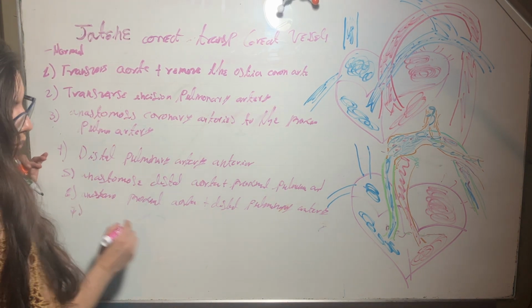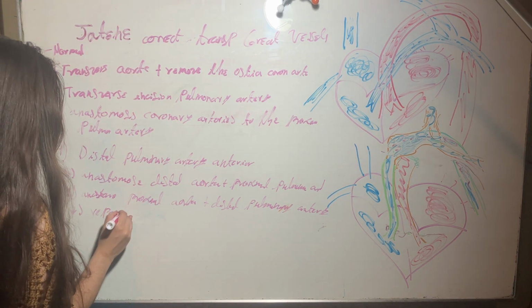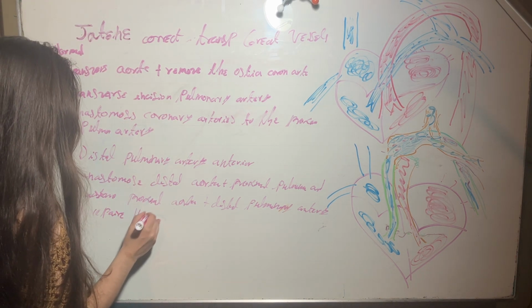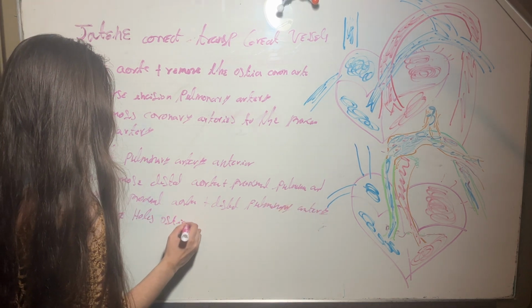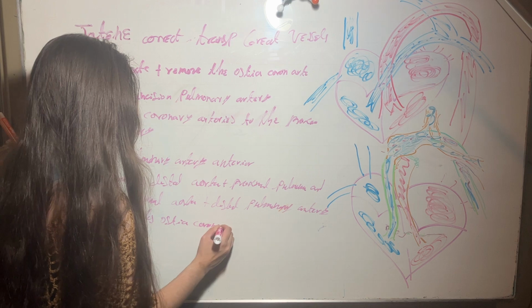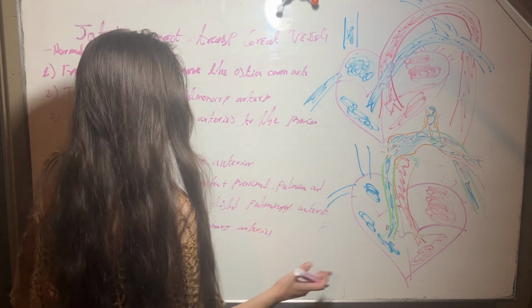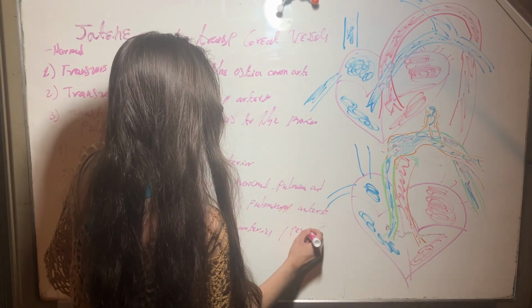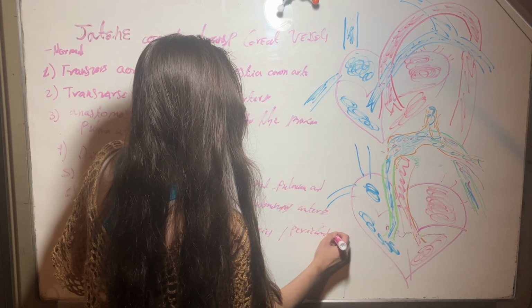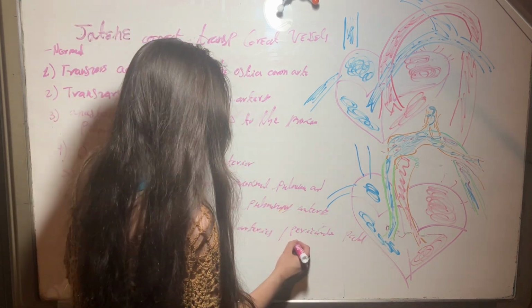And next step, we repair the holes that we left in the ostia of the coronary arteries, and we close these holes with a pericardium patch, or it could be a synthetic material.